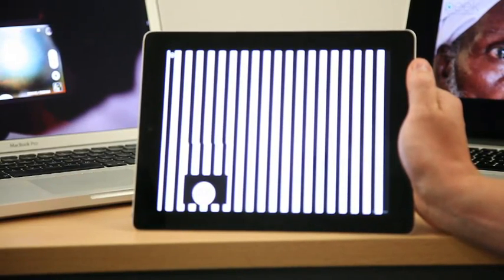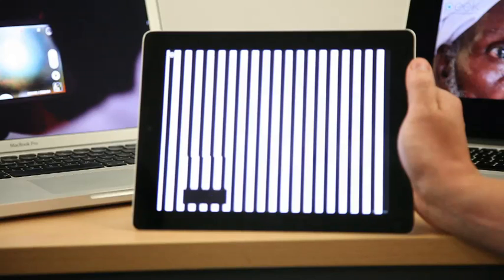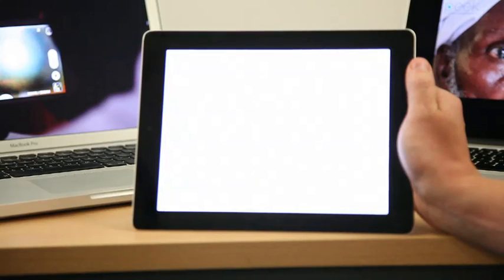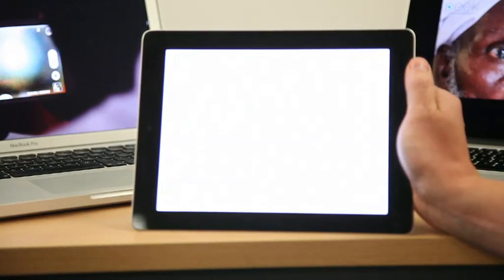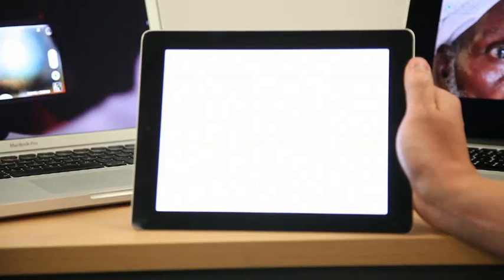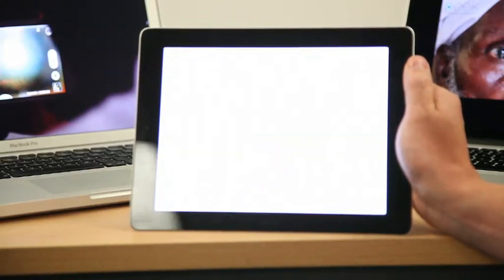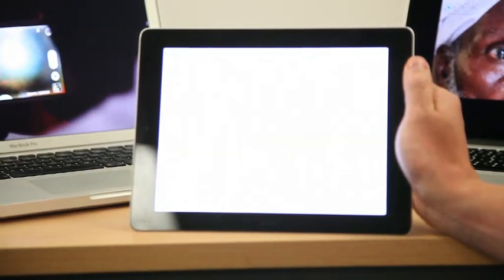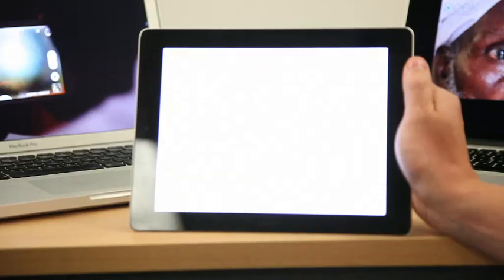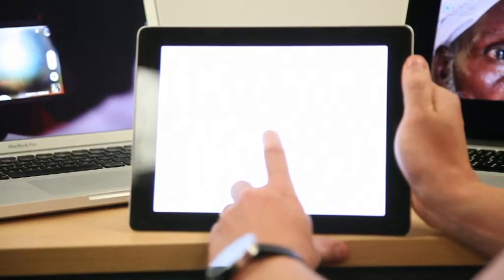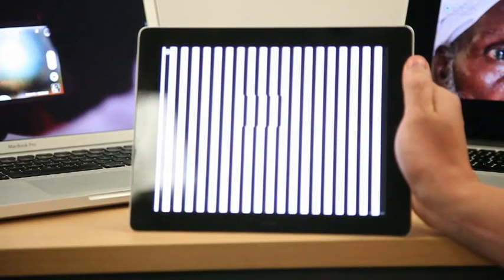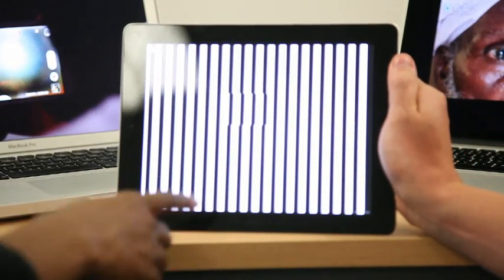So what is this testing? This is testing visual acuity. It's the same information that we're extracting as the tumbling E test, but in a way that a child can relate to. Let's have another go.